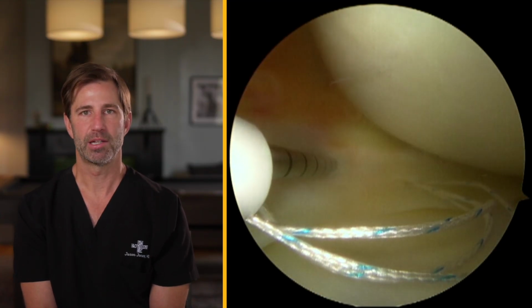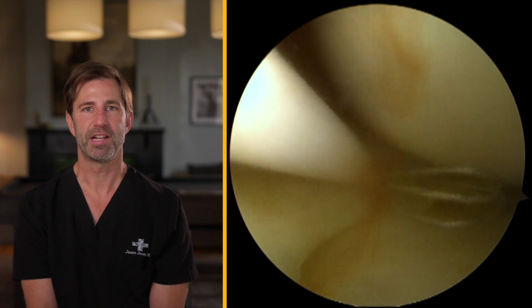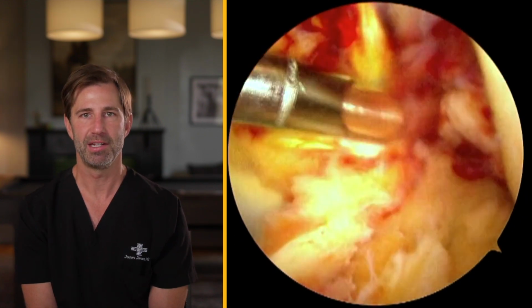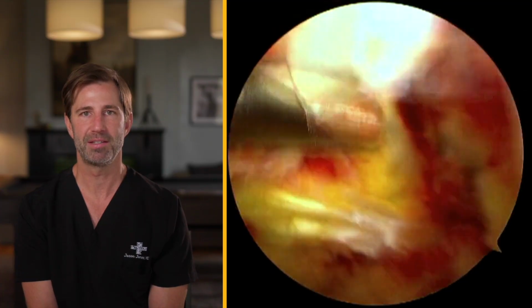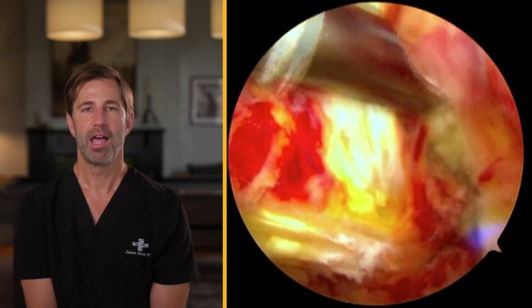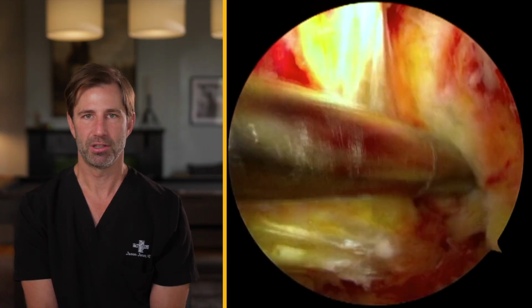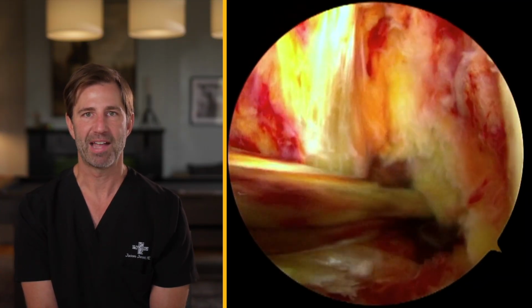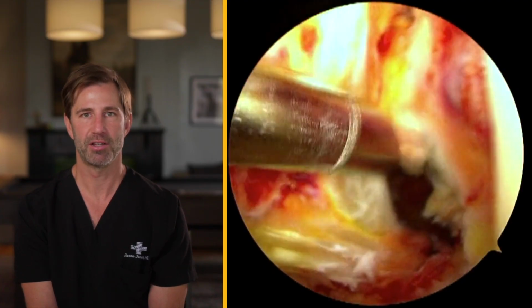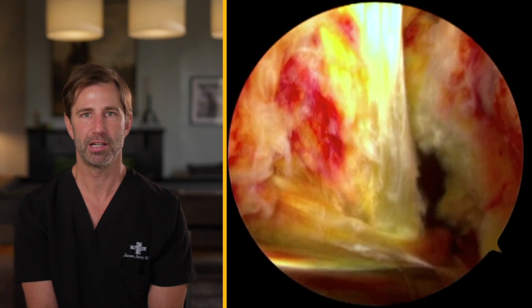The next part of the case that we'll look at is what's called the intercondylar notch of the knee. This is where the ligaments that reside inside the knee rest. There's the PCL, which we can see here on the left side of the screen. The ACL used to live here. What we see now is a massive scar tissue. This is the body's poor attempt to try to reconstitute and heal the anterior cruciate ligament.